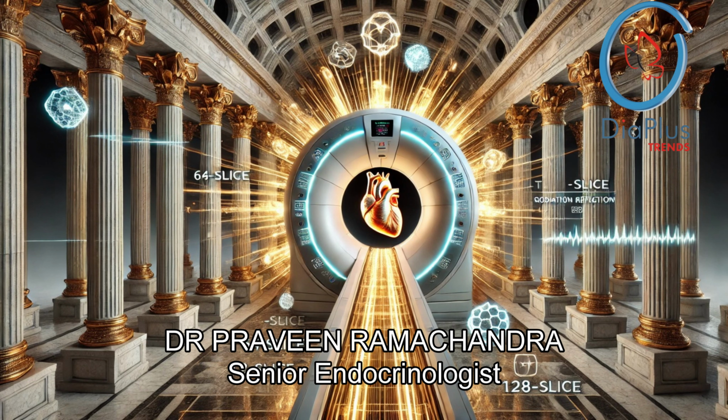It is. And that's where temporal resolution comes in. It basically describes how quickly the scanner can actually capture the image. This is where dual source CT scanners really shine. They use two X-ray sources and two detectors, which effectively doubles the scan speed. This is especially helpful for patients who might have faster heart rates or irregular heartbeats. So it's almost like having two cameras taking pictures at the same time. Yes, so you don't miss anything. Precisely.